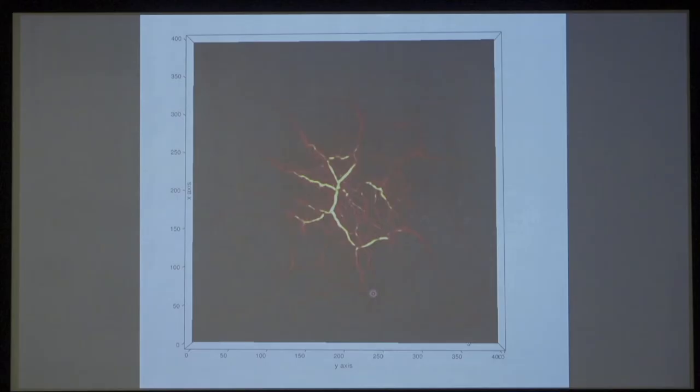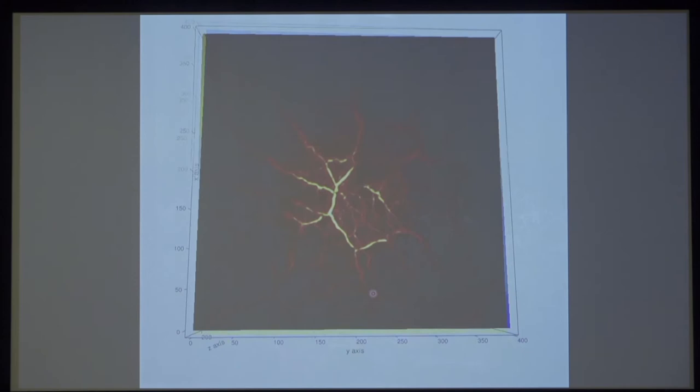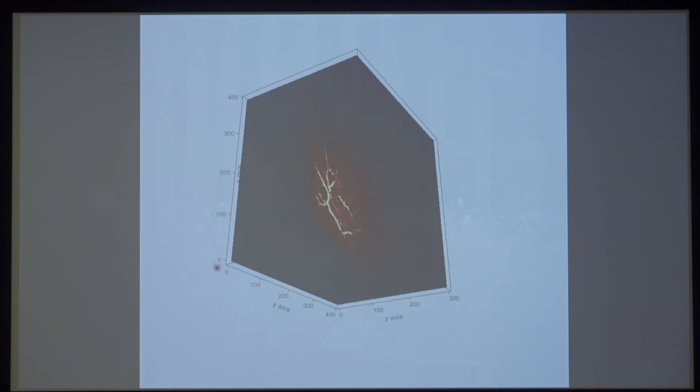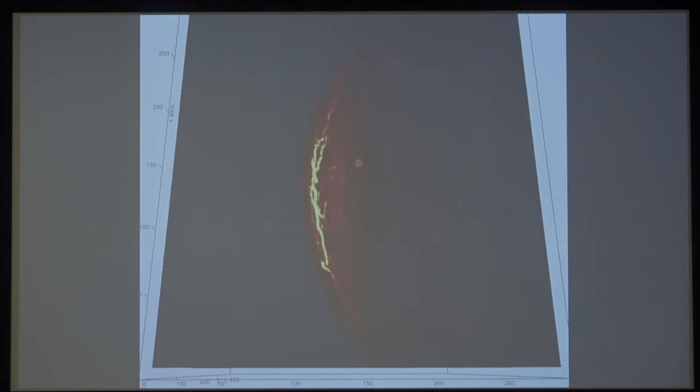This is a very recent demonstration, and it shows that for the first time, we can see the cortical signal. You can see that at the right angle, part of the region is in the cortical layer that's below the skull. We're very excited to get this data, and we're looking forward to getting even sharper images. Right now, you can see some of the vessels show up quite well, and now we're testing the functional version as well.